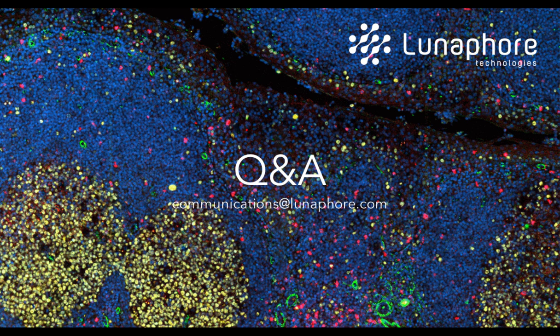Excellent. Someone else is asking here, what's the maximum number of markers? I think it says tried with this technology. I'm guessing that's the typo. Tried with this technology. Yes, we have data so far showing 30-plex with our technology, but the count keeps increasing as we speak.